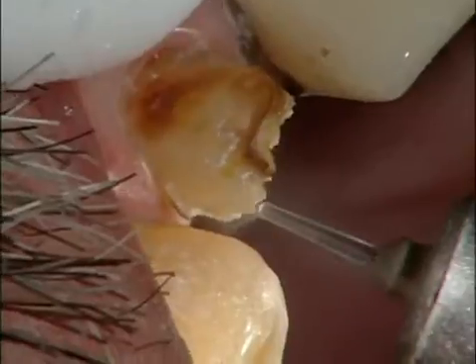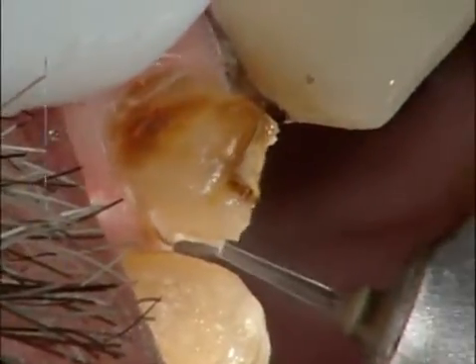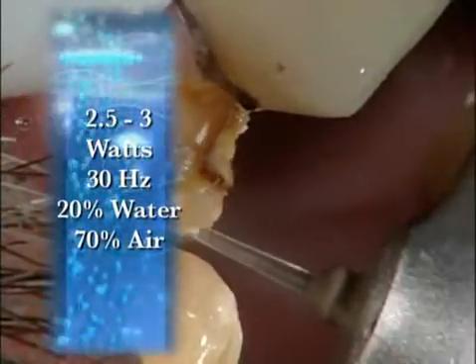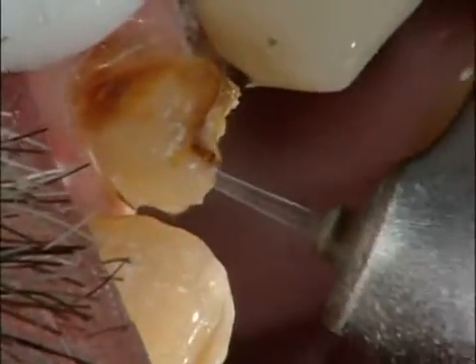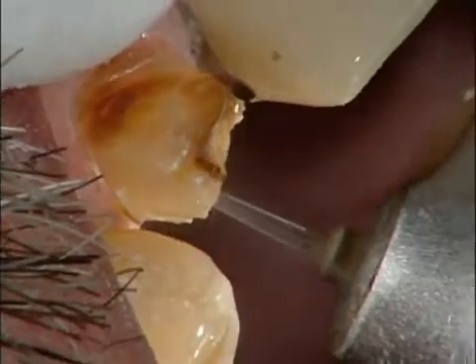But to fine-tune your margin, if you turn the power down to 2.5 to 3 watts, at 30 hertz, 20% water and 70% air, you can make a real fine, smooth margin. Again, using high magnification, 4 to 6x with a headlight, allows you to see really well.